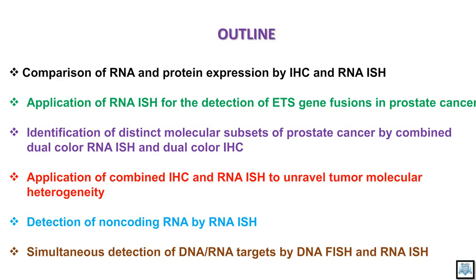Then I will show you how we can detect the ETS gene fusions in prostate cancer. As many of you know, many ETS-related gene fusions have been identified in prostate cancer. Since we don't have good antibodies for all of the ETS gene fusions, we have developed the RNA in situ hybridization procedure for the tissue-level expression of these genes.